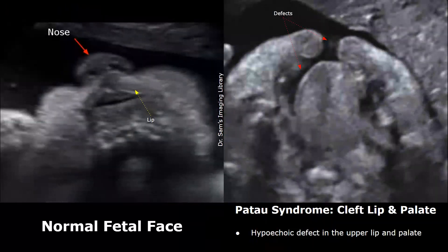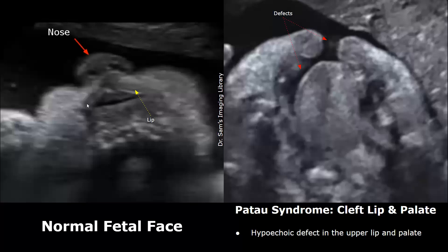Another common facial abnormality includes cleft lip and palate. These images show transverse oblique views at the fetal mouth. This is the normal image showing the fetal nose, upper lip and mouth. No hypoechoic defect is present in the normal image. But if there is a cleft lip and palate, you will find a hypoechoic defect in the upper lip and a hypoechoic defect in the palate. This type of appearance indicates a cleft lip and palate.